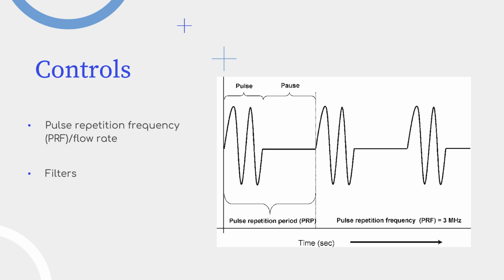Spectral and color Doppler controls are often not properly understood by the operator, because the modern systems available have excellent application software to set the parameters for differing flow situations within the body. However, it is necessary to understand the functions of these controls in order to optimize the system for individual, difficult cases. First control is pulse repetition frequency, also known as flow rate or scale. This determines the sampling time that is required to process the Doppler information. Since low flow must be sampled for a longer period of time to accurately analyze the information for color display, low PRF must be selected for these situations.